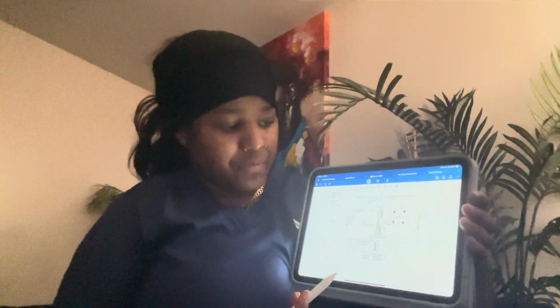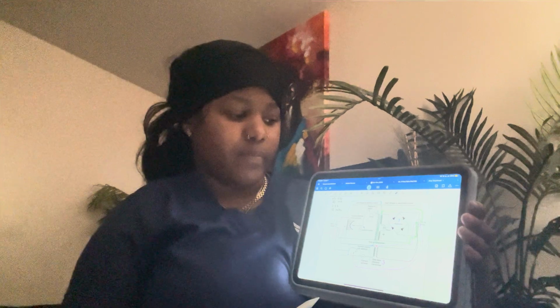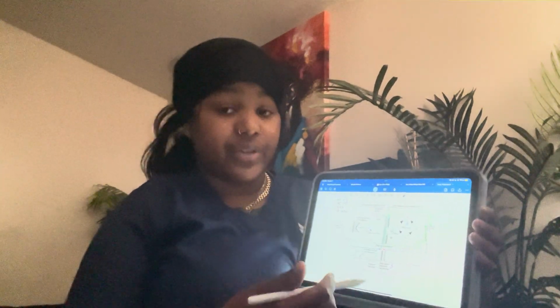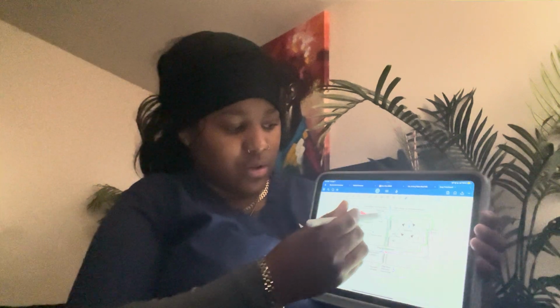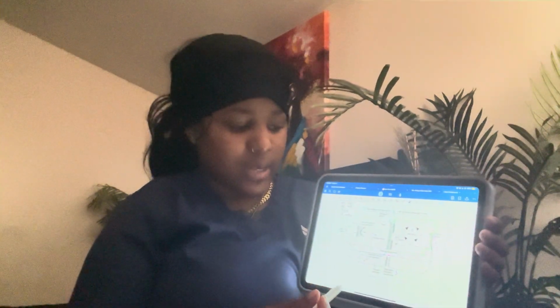So just to give a brief today, the X-ray tube is a very important component, and it is important to have the comprehension of the different parts of the X-ray tube. There we have the low voltage side, and then we also have the high voltage side, which I'll get more into as I go on.